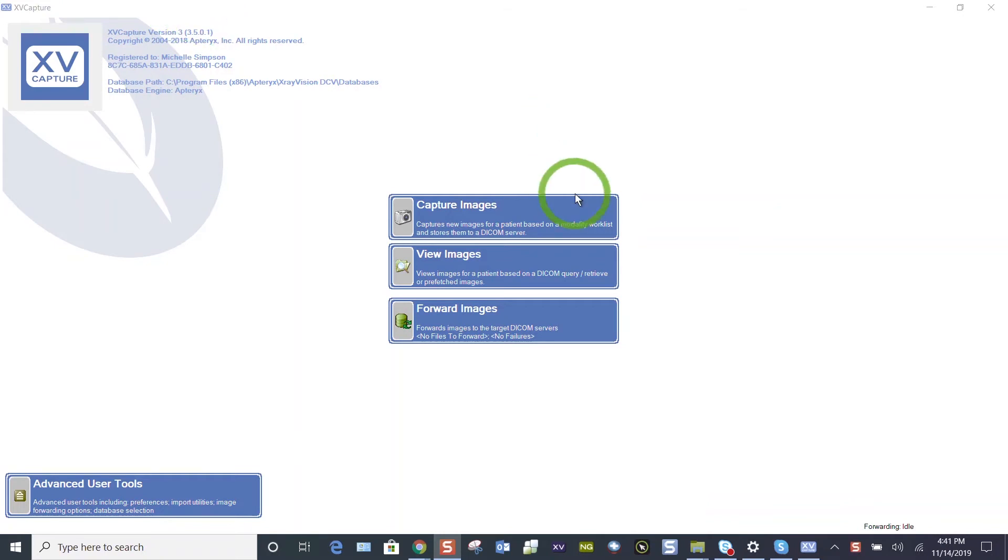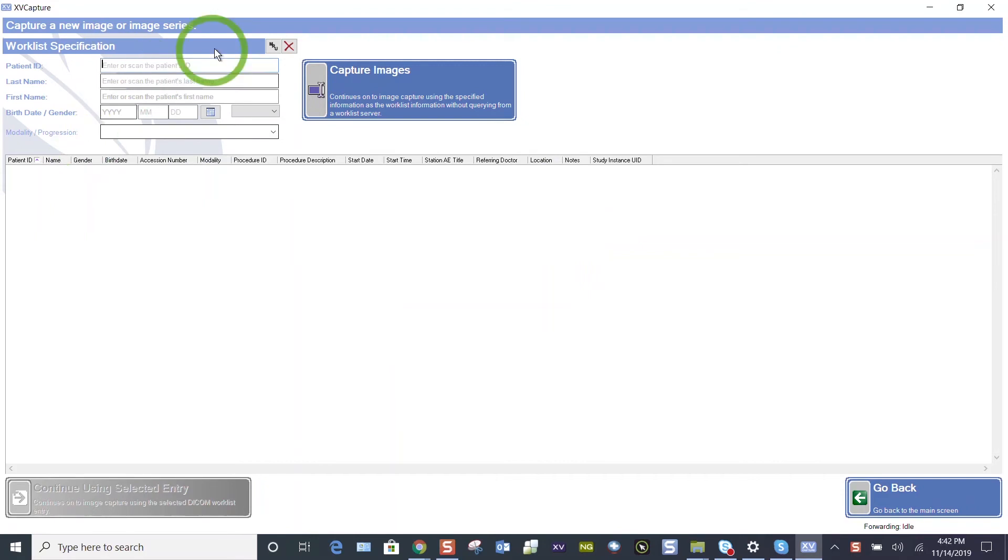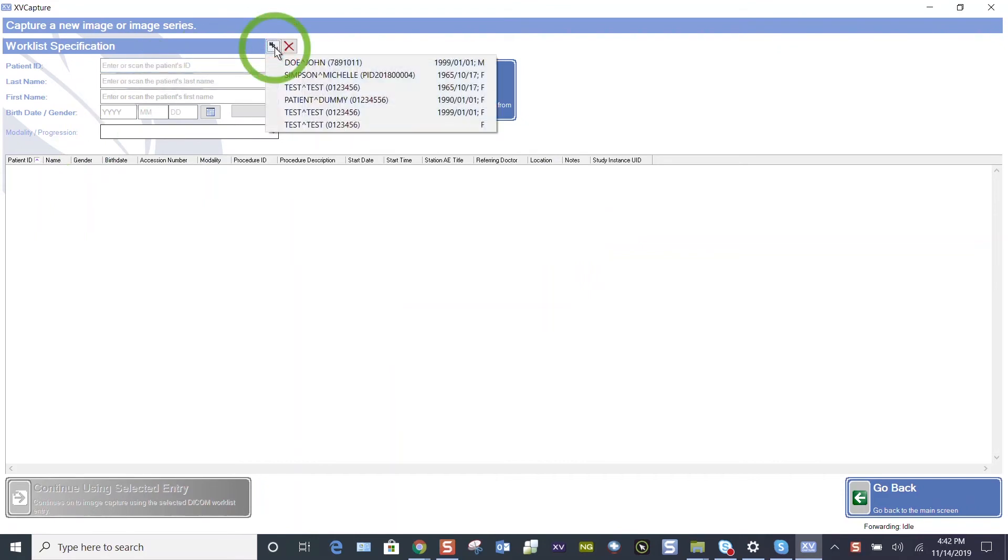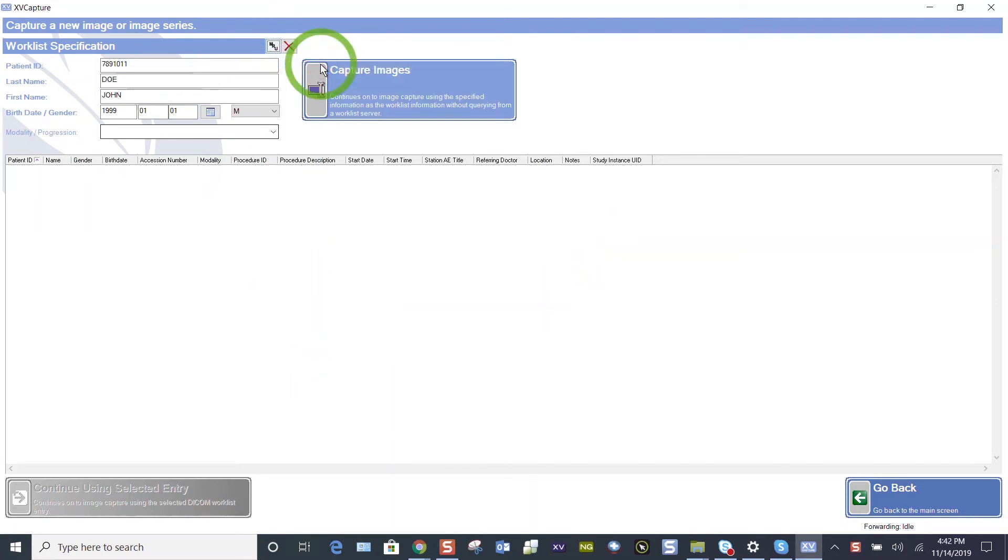Let's click on Capture. When you use that bridge associated with your particular software, your patient's information will auto-populate here. I'm going to use my MRU, my most recently used list. It's going to populate your last 20 patients that you saw. I'm going to use John Doe since I can't bridge over. I don't have everybody's practice management software.